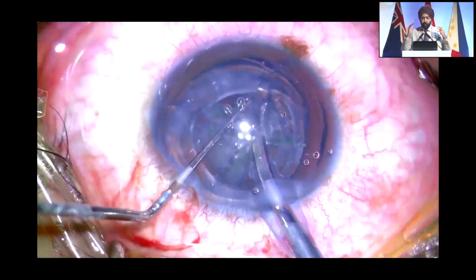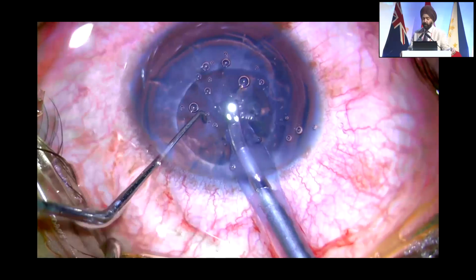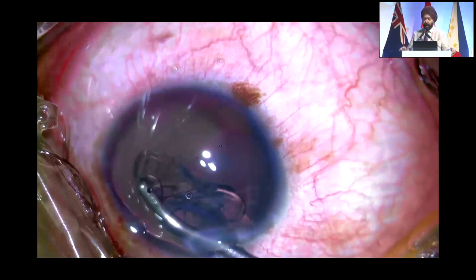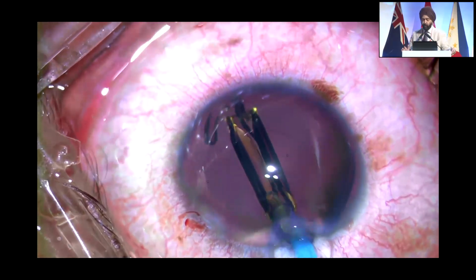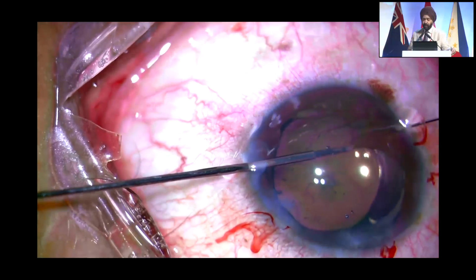But the femto will give you, irrespective of whether there is vitreous there or not, whether there is a subluxation or not, you can center the capsulotomy onto the capsular bag, and you have very little problem in removing the pre-chopped nucleus which is there. So subluxated cataracts, again, a fantastic tool that is there.